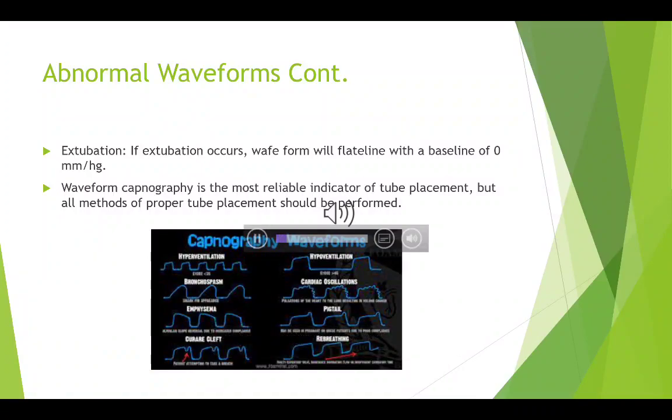Going back to waveform capnography being a standard of care, lastly, another abnormal waveform is going to be extubation. Your waveform is going to be a flat line with a baseline of zero. It's the most reliable indicator of tube placement, but you should also auscultate as well to confirm that you have a properly placed tube.